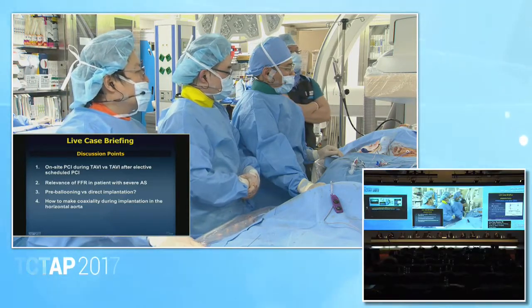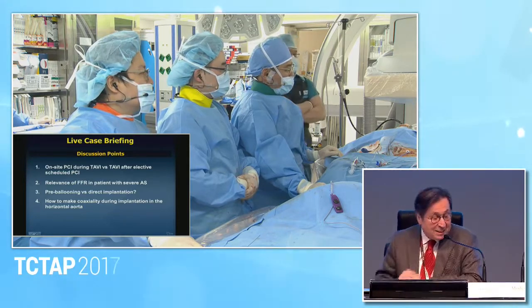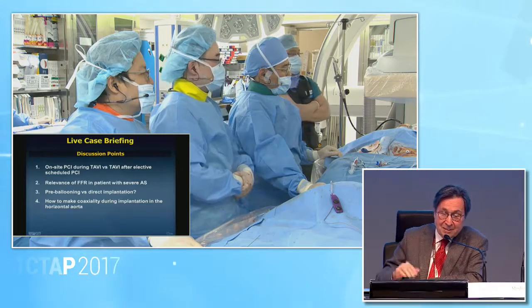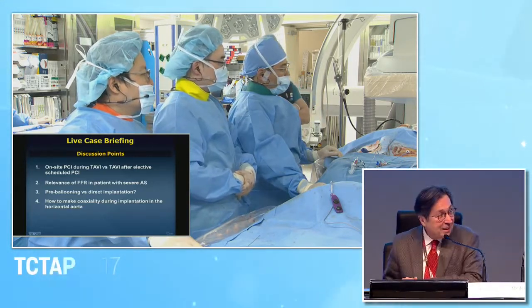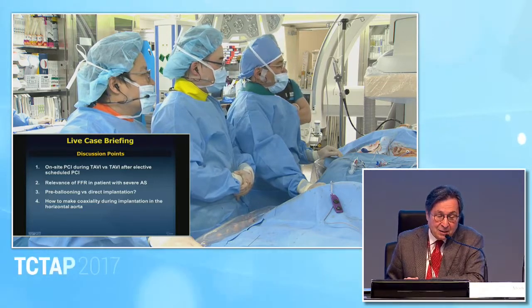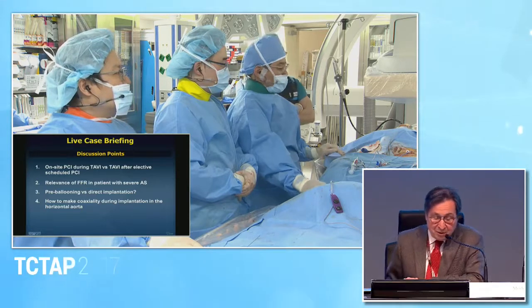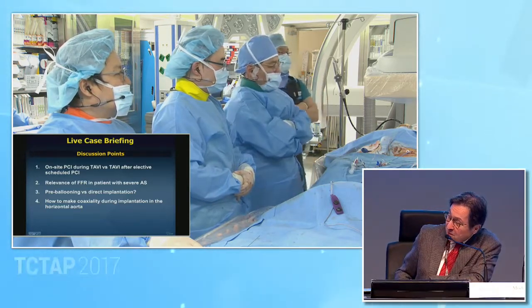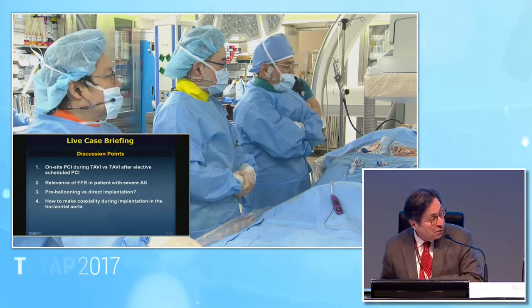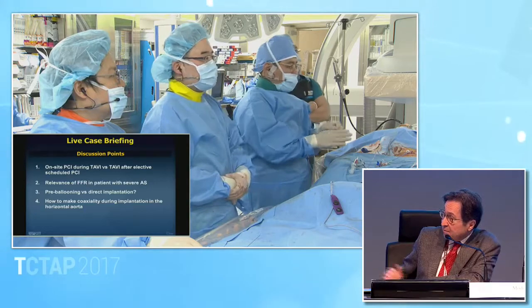Interesting. I tend to agree with Dr. Ye, because we also say that if we don't have the FFR, would we jump and do things to the proximal LAD and left main? We probably wouldn't. So I think that's one thing, and we're going to discuss the FFR issue also. But let me ask other members of the panel: is there anybody that's doing FFR frequently in the AS patients at the time of TAVI?